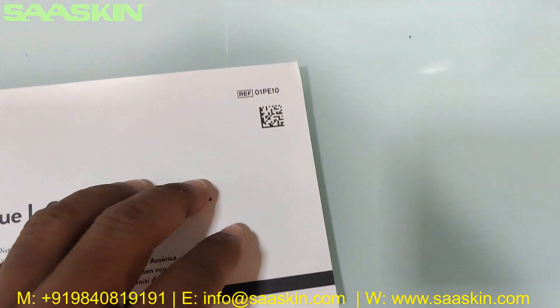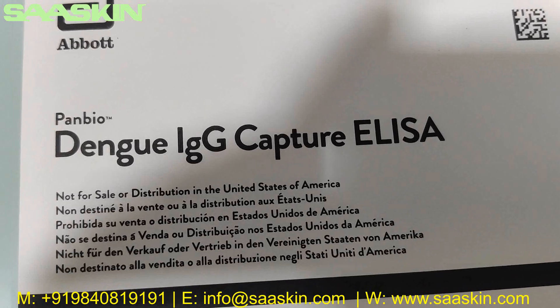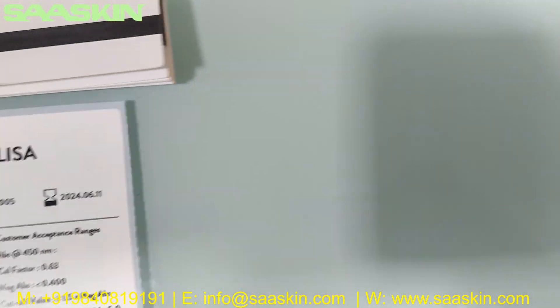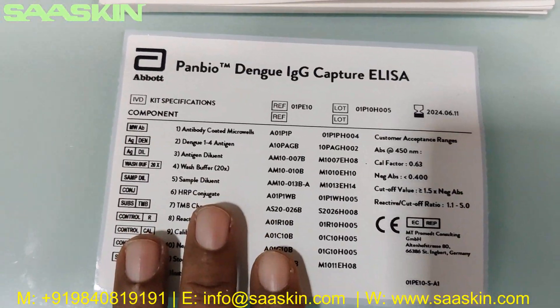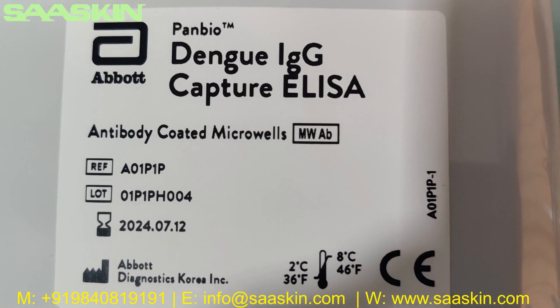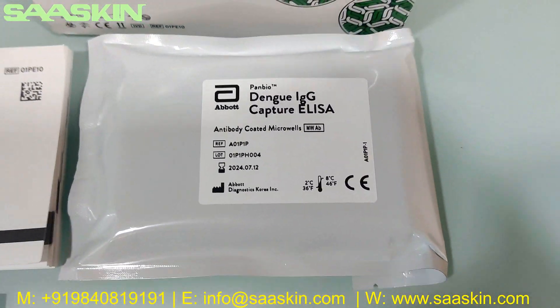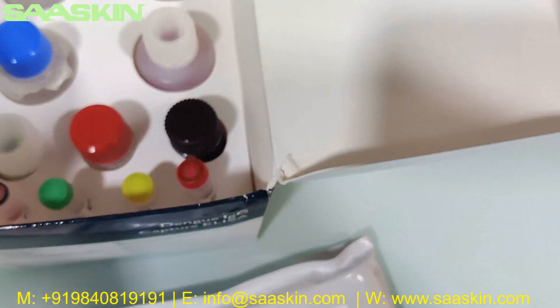Here we go — in this box you can see there is a catalogue, a complete manual-type catalogue. You can see that it says Dengue IgG Capture ELISA, and inside you have a sticker. The key contents are mentioned here on the sticker. And inside you can see what we got here: the Dengue IgG Capture ELISA antibody-coated microplate, the 96-well plate — you can see this here.